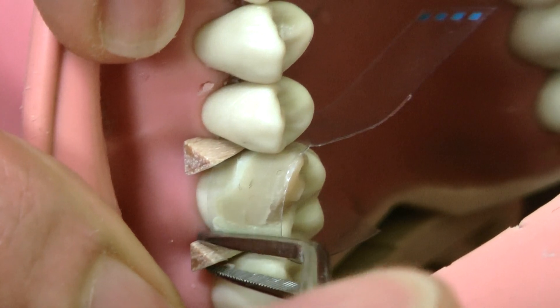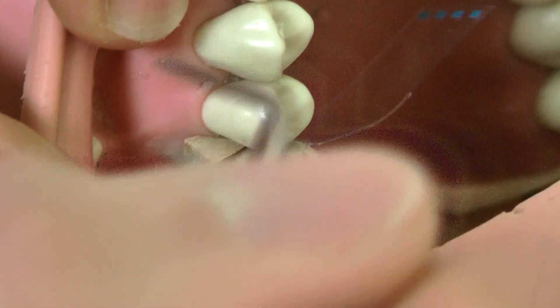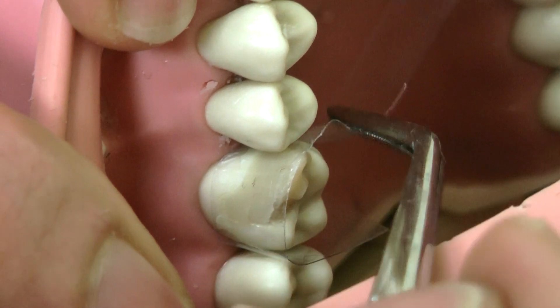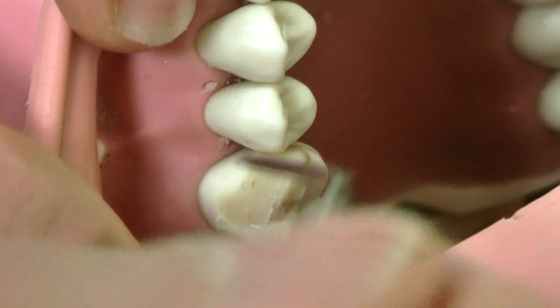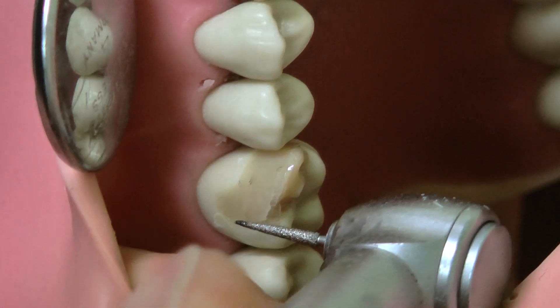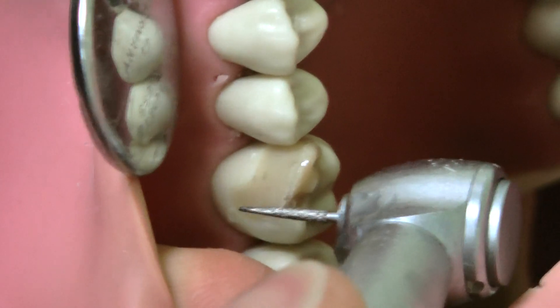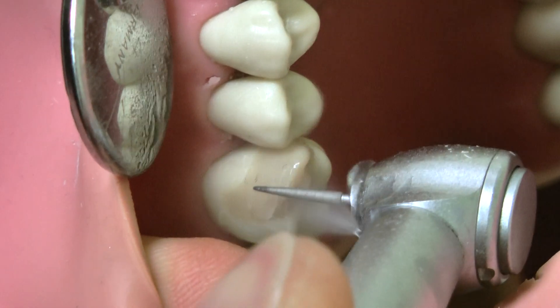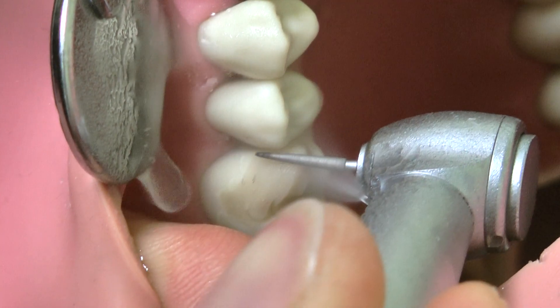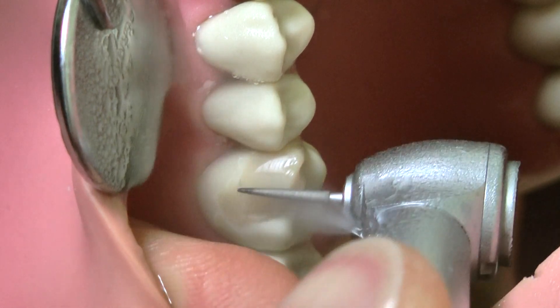Now we are removing the wedges and mylar strip gently, because we did not etch these plastic teeth, so the bonding is not as strong as the bond to natural teeth — be very careful while removing this. Now it's time for polishing and shaping. I'll start from where I can see easiest, which is the buccal. Be very gentle, as the composite is sometimes very soft at this point.